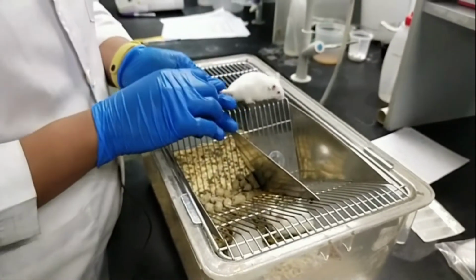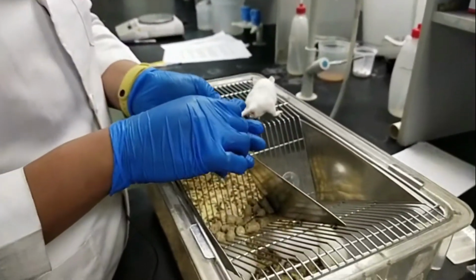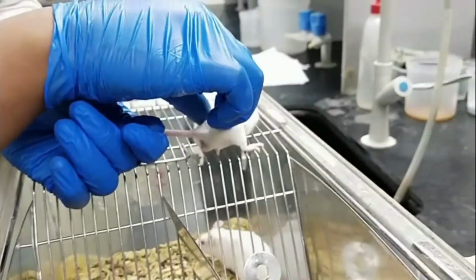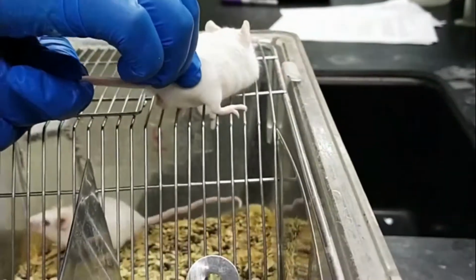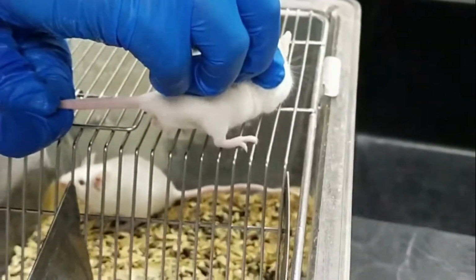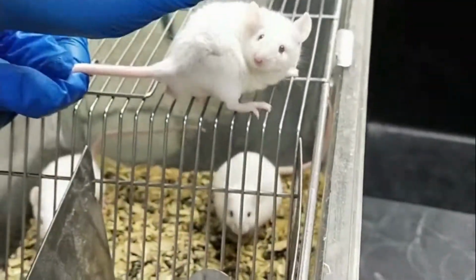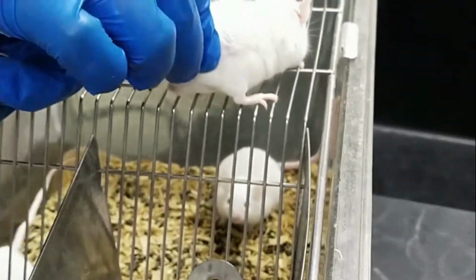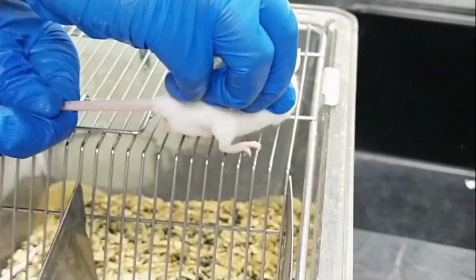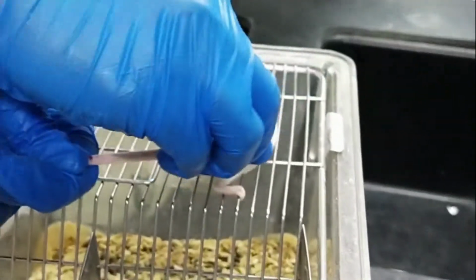So first we're going to teach you how to grab the animal. Normally to grab the animal, we're going to grab the skin starting from here. We need to bring the skin forward until it reaches here, and then when our finger reaches this part of the animal, we're going to grab using our finger. Normally we can use these 3 fingers to grab our animal. So we're going to do it again. 3, 2, 1. We're going to push the skin up, then we're going to grab the skin of the animal.